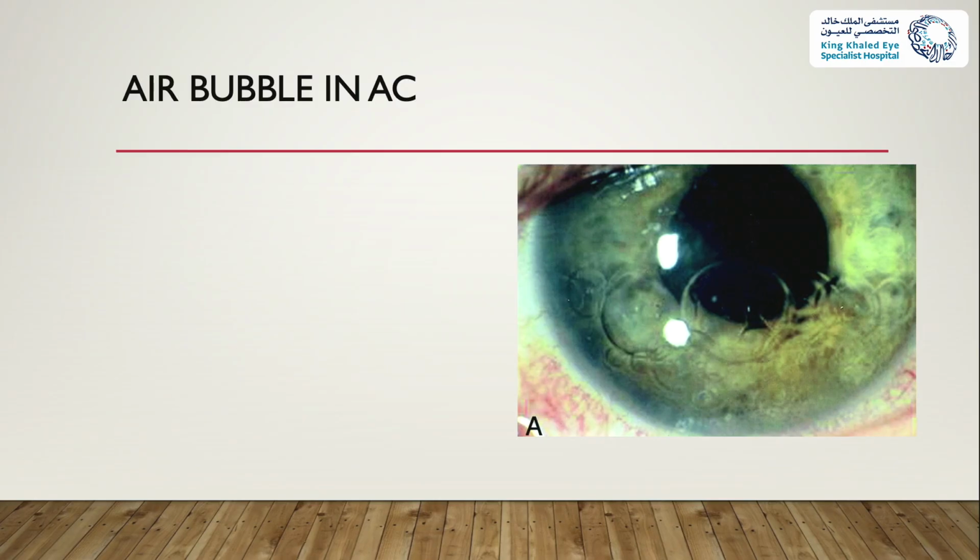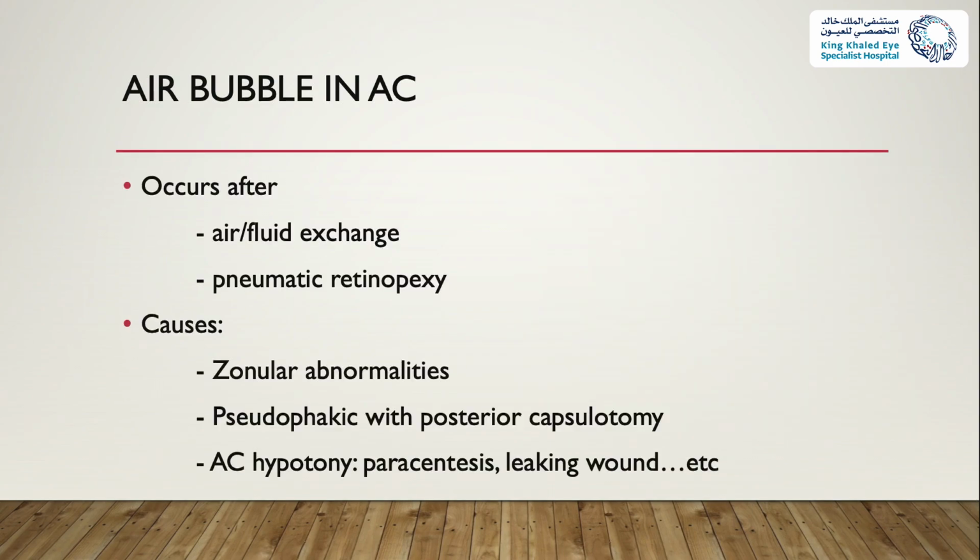Yeah, very good. I was just testing to see if people are paying attention, or whether you have had coffee this morning. So I cheated you. Those are not air bubbles in the AC, because those bubbles are sitting on the bottom of the anterior chamber, so they cannot be air, because air floats. Thank you for pointing that out. So when does it happen? It happens maybe after air fluid exchange. It can happen after pneumatic retinopexy.